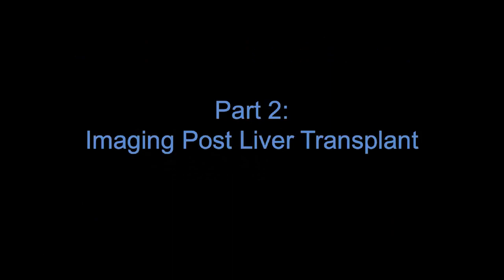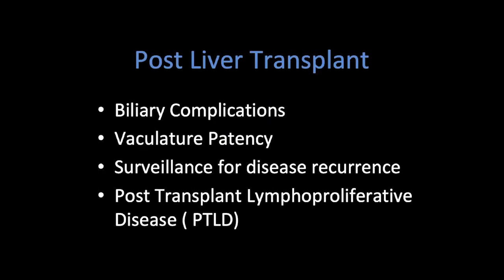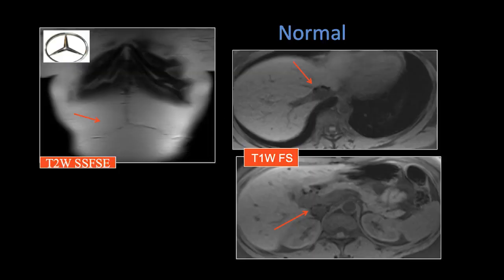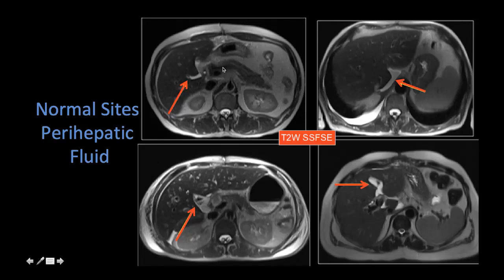Now let's move on to part two — imaging post liver transplant. Post liver transplant complications: the reasons patients come to MRI include biliary complications, assessment of vascular patency, disease surveillance, and sometimes for PTLD. In these post-transplant patients, you'll see the Mercedes-Benz incision, susceptibility artifact along the caval anastomosis superior and inferior, and small fluid collections often along the ligamentum venosum, the portohepatic region, and along the ligamentum teres — that's a normal appearance.